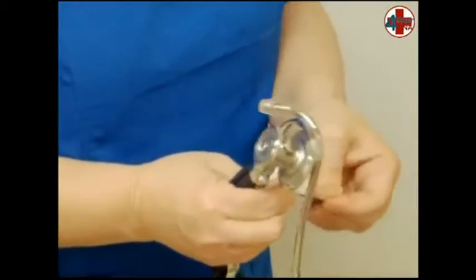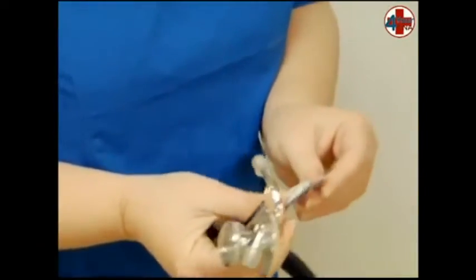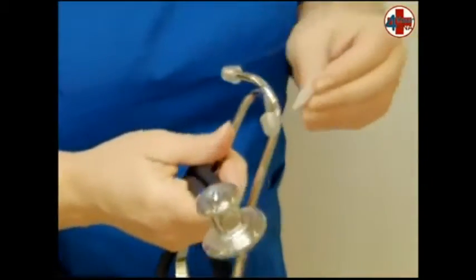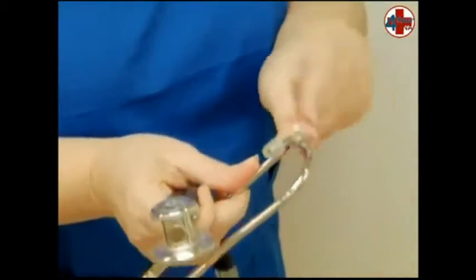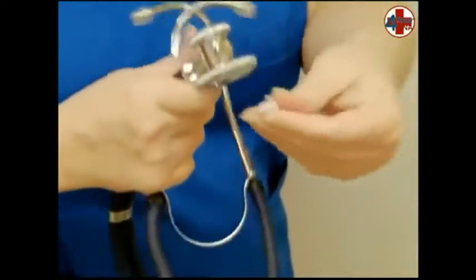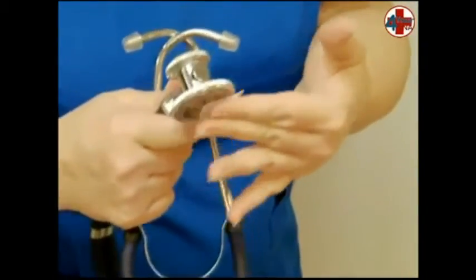Pick up an alcohol pad and explain to the patient what you will be doing. Open the alcohol pad and clean each earpiece — yours and the evaluator's — and the large diaphragm on your stethoscope. Throw the alcohol pad away.